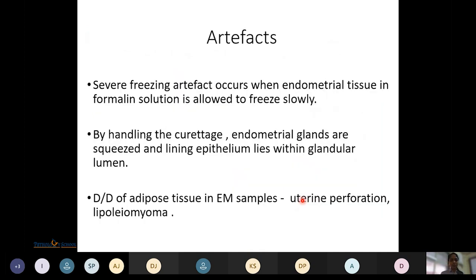Artifacts to be aware of: freezing artifacts occur when endometrial tissue in formalin solution is allowed to freeze slowly. Handling of the curette can squeeze endometrial glands so that lining epithelium lies within the glandular lumen, giving a gland-within-gland appearance. The differential diagnosis for adipose tissue in endometrial samples includes uterine perforation or lipoleiomyoma, and the clinician should be informed promptly.